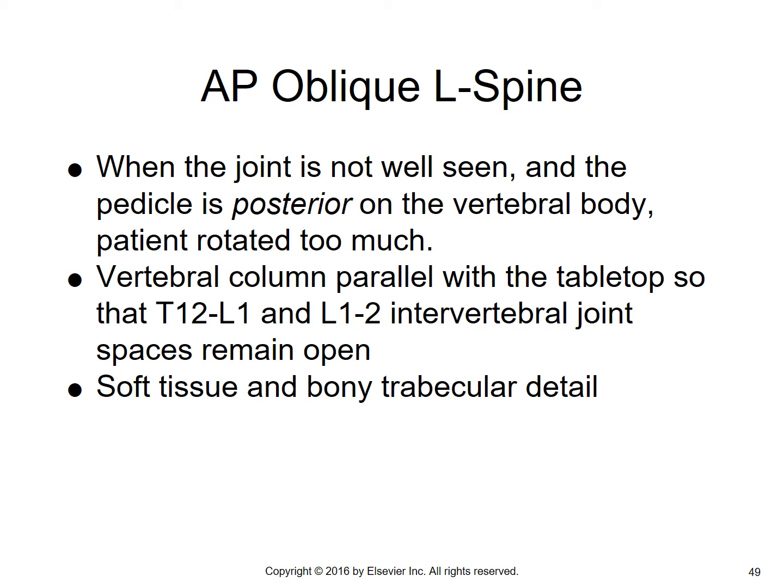Vertebral column is parallel with the tabletop, so T12 to L1 and L1 and 2 intervertebral joint spaces remain open, and you're seeing soft tissue and bony trabecular detail.